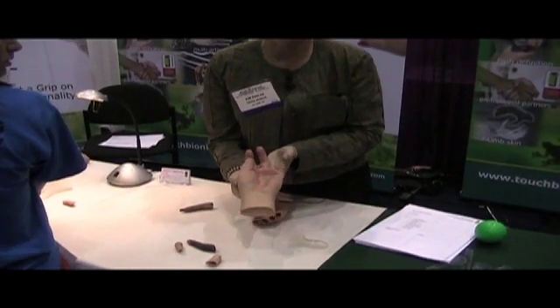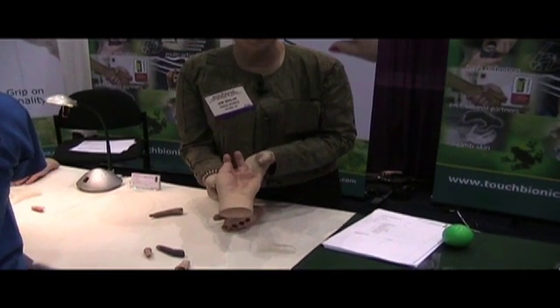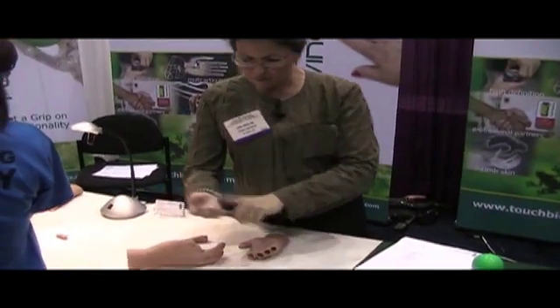Our artists pay a lot of attention to the sculpting as well as the pigmentation of each prosthesis. While I've been showing you this prosthesis, I've been holding it with my prosthesis.